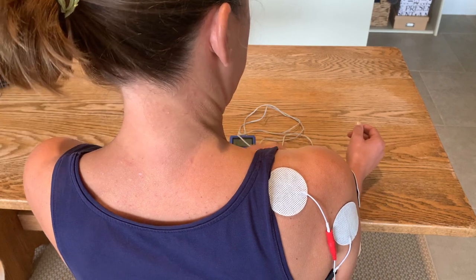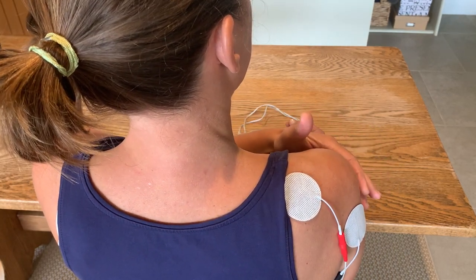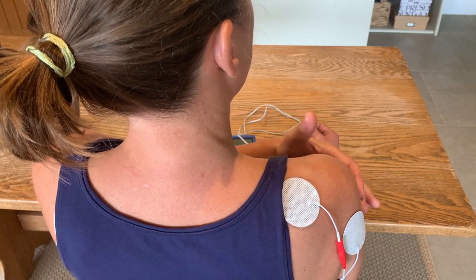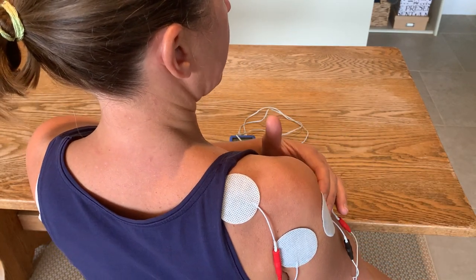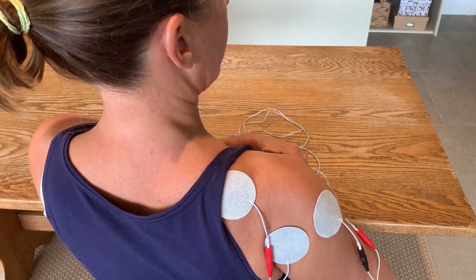Then three around the top of the upper arm. Run your finger down to the gap just off your humeral head, which is where the subluxation is. Then just beneath that, place one round the back of the upper arm, one at the mid of the upper arm, and one right round the front of the upper arm.